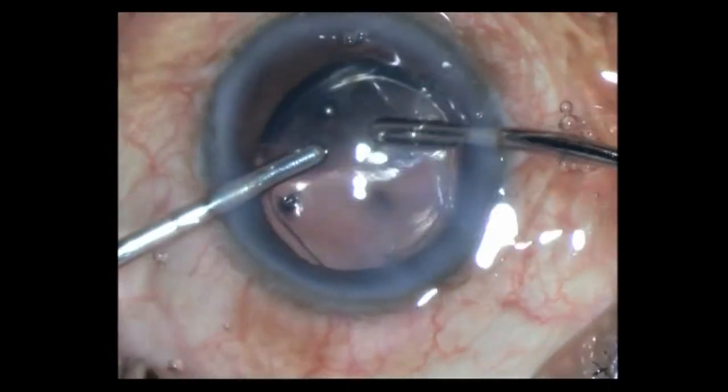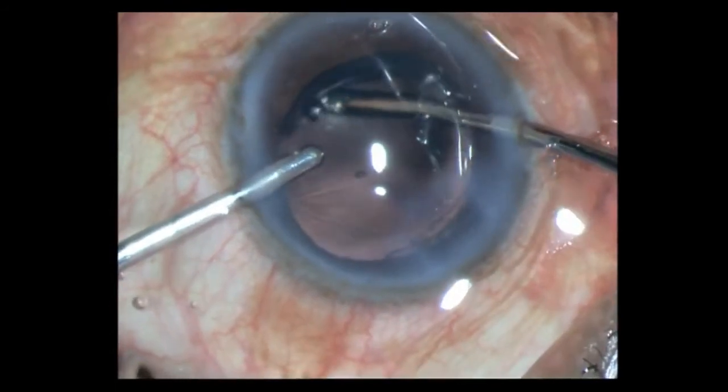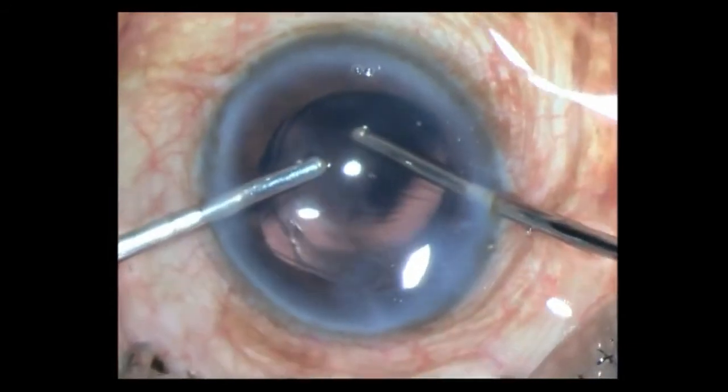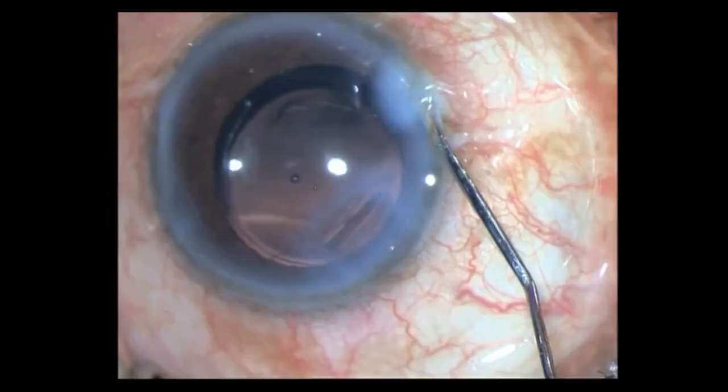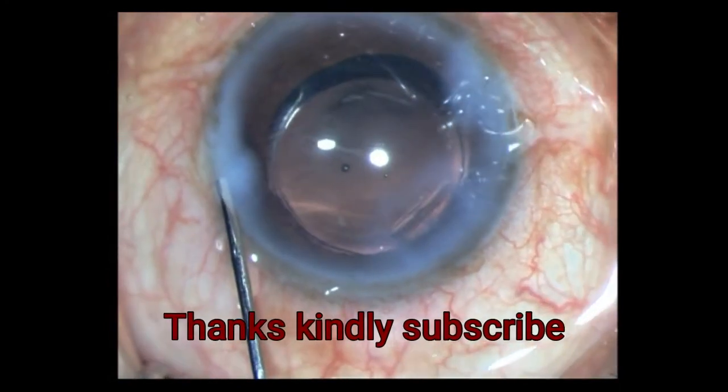Here are the final touches where I am aspirating the HPMC from within the chamber. I conclude the surgery with an intracameral antibiotic and hydrating the wounds. Thank you so much for watching.